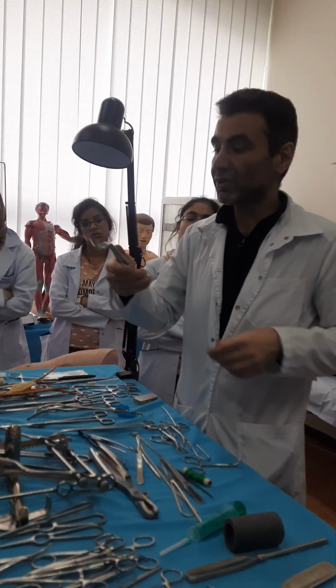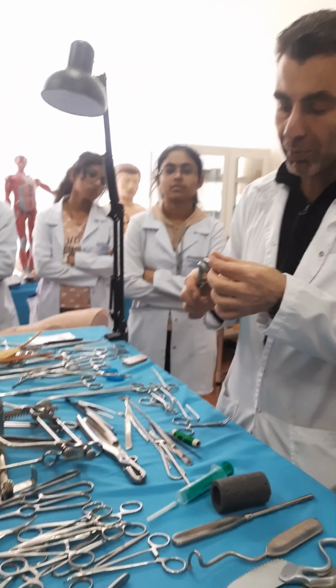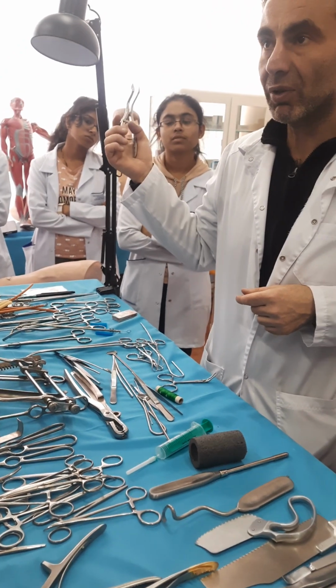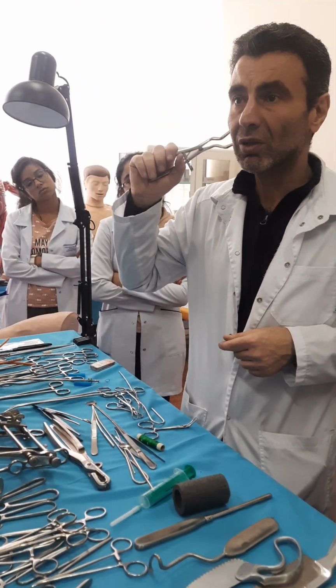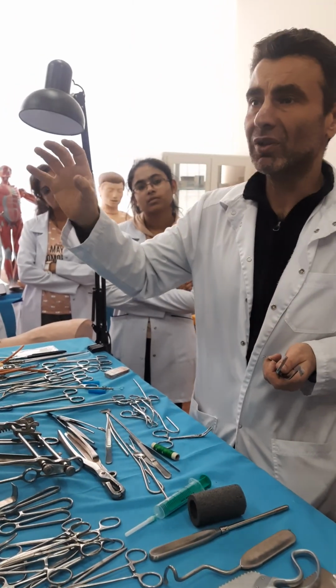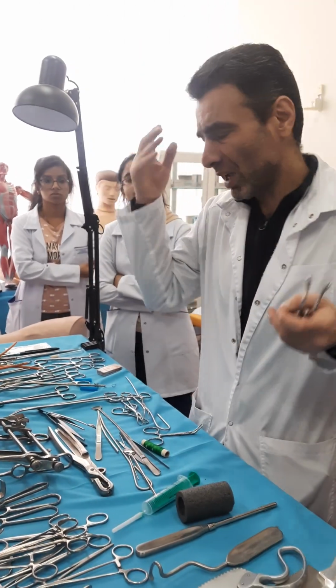For oral surgeries, the mouth retractor, with rubber portions inserted on the tips, angled strongly outside from the mouth. You put it between the molars, you open it as you want, and it has a lock. Useful if the patient has spasms or if it is a child that cannot fix any difference.